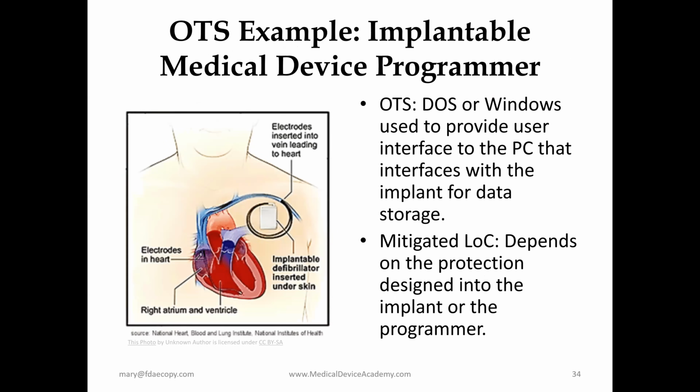So another example is the implantable medical device programmer. This could be like for an automatic defibrillator or something that's implanted in the body that you can access information through the skin or something similar. The off-the-shelf software in this case is described as DOS or Windows that is used to provide the user interface to the PC that interfaces with the implant. So this isn't the actual implant. This is the outside PC that's interacting with the implant.